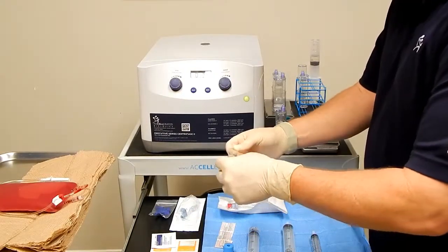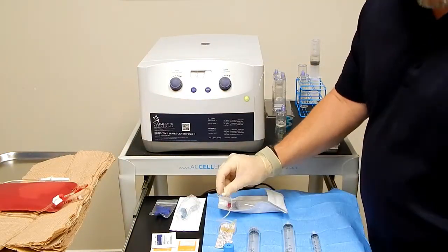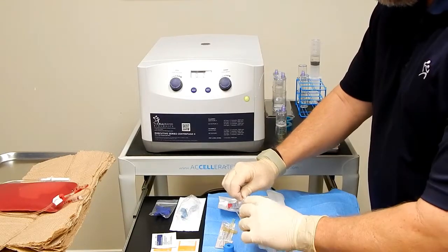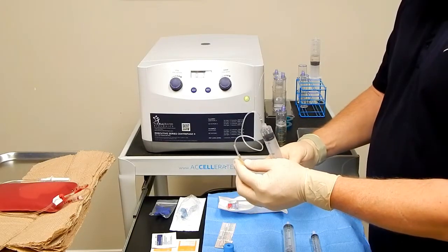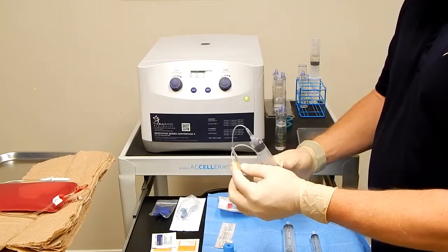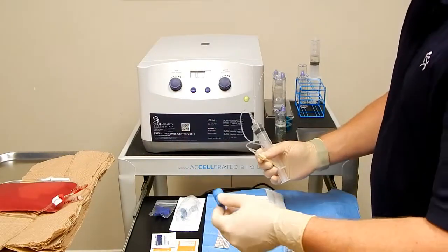We're then ready to use our butterfly needle. Do just a luer lock connection, tighten that up. I do prime the tube just so the anticoagulant is all the way through the tube and peeks out just the tip. And then you have your alcohol and tourniquet to get your blood.